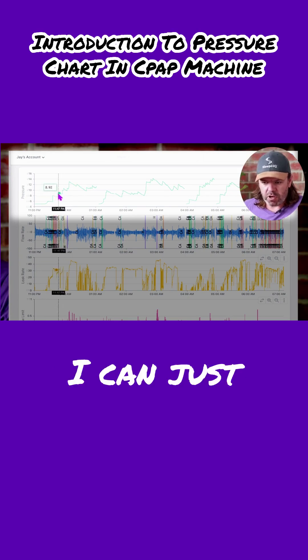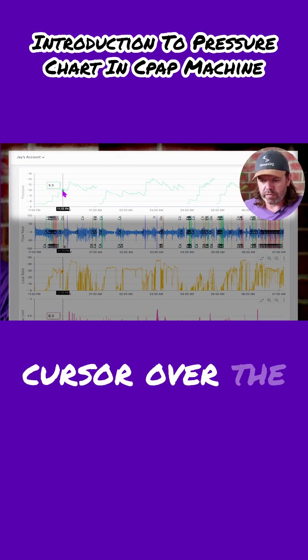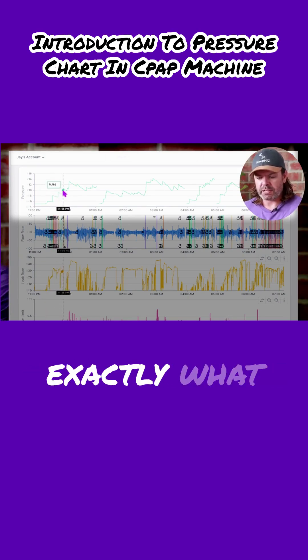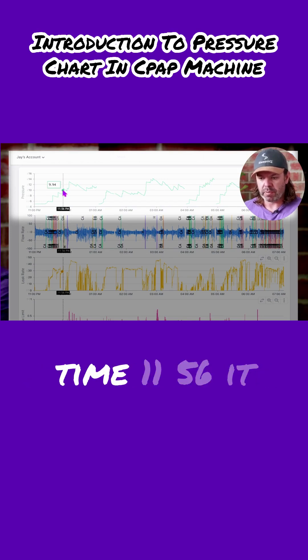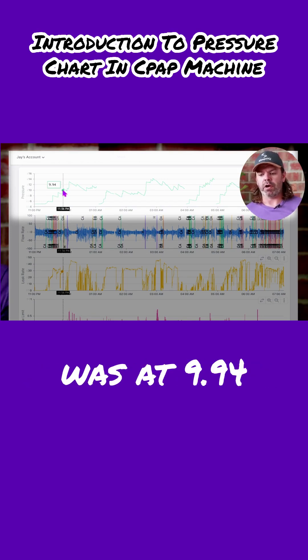I can just hover my cursor over the line and it tells me exactly what pressure it is at that point in time. At 11:56, it was at 9.94.